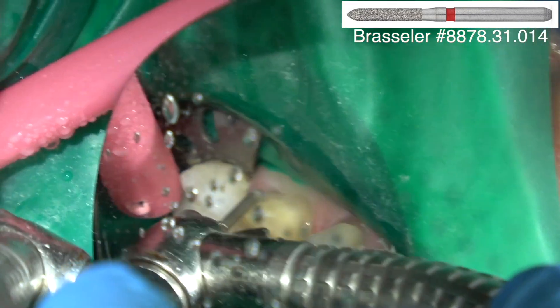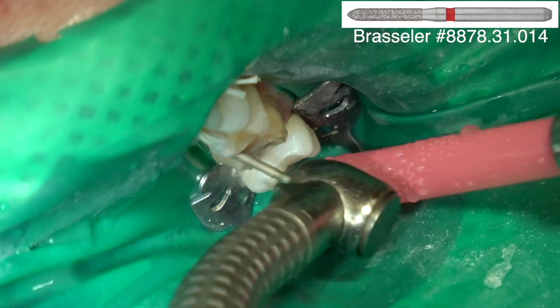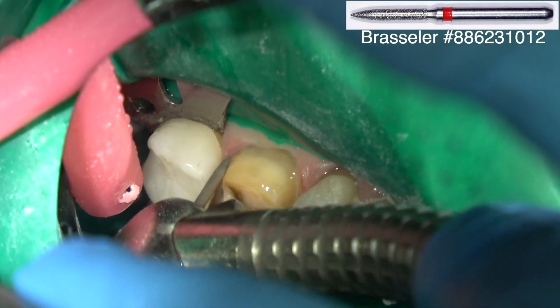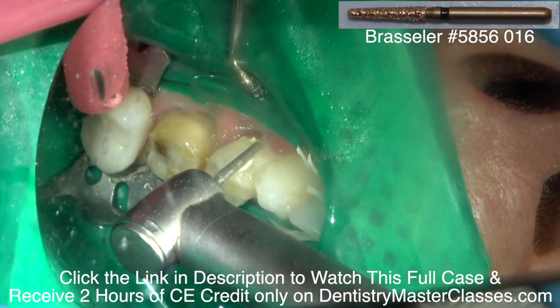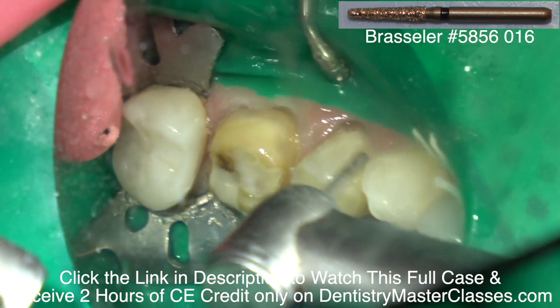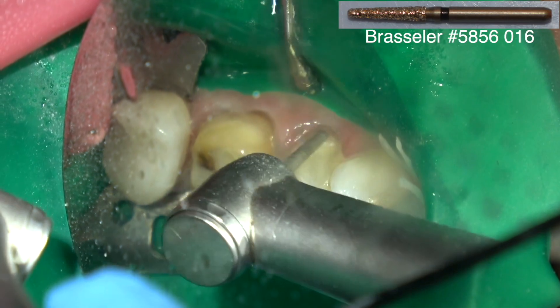Any time you've got dentin exposed on the facial, you don't want to prep deeply into that dentin unless you're performing endodontics, because you can make a tooth hypersensitive that was not hypersensitive preoperatively. Rounding the facial interproximal line angles and the interproximal palatal line angle. She's already done a significant part of the preparation with the abfraction — you're just connecting the tooth to the abfraction, not prepping into it, just getting rid of the secondary dentin and smoothing it.